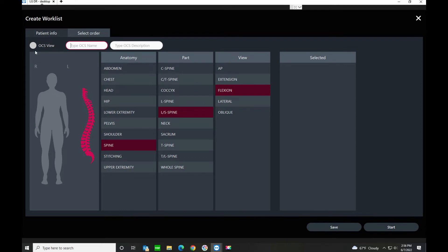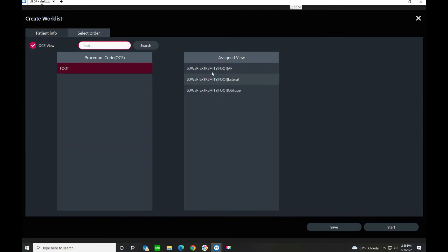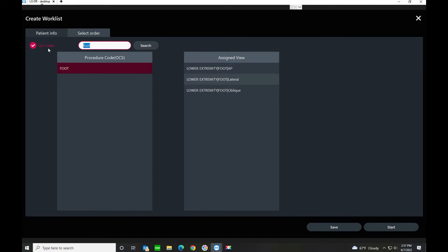The other way you can do it is called OCS view, and this is a feature that works in conjunction with your modality worklist. It sends over procedure codes from your modality worklist. If I click on OCS view and type in 'foot,' these are the assigned views already in here. If I were to click Start, this would create an exam with three views. There are a lot of different pre-programmed procedure codes in the software, and we can also help you build more.